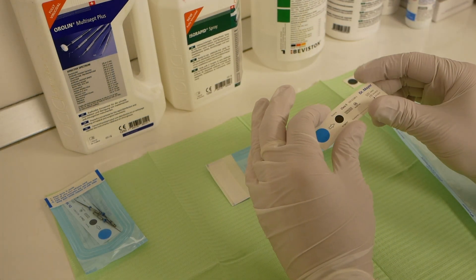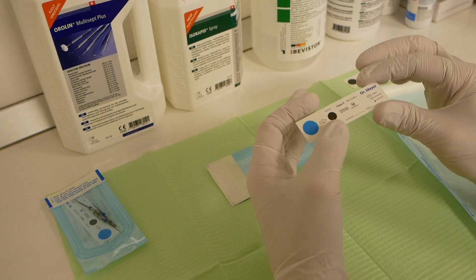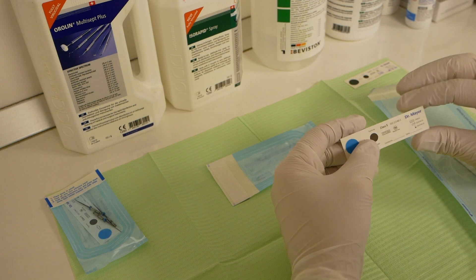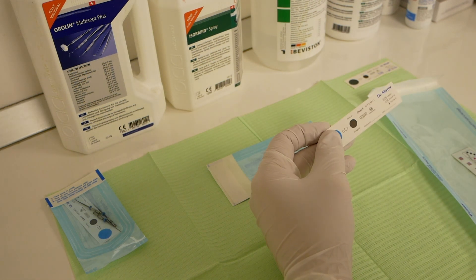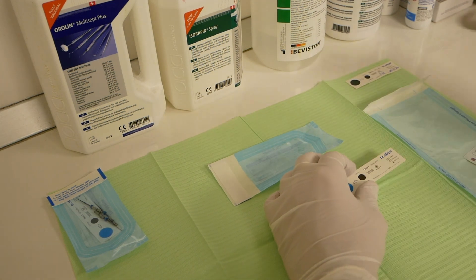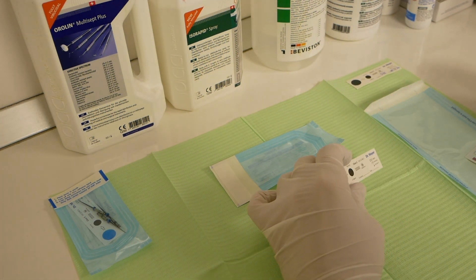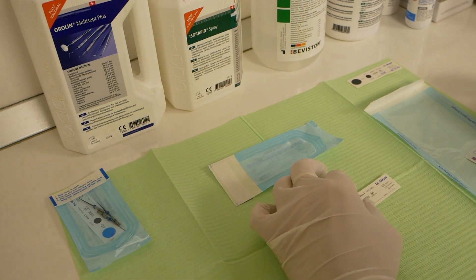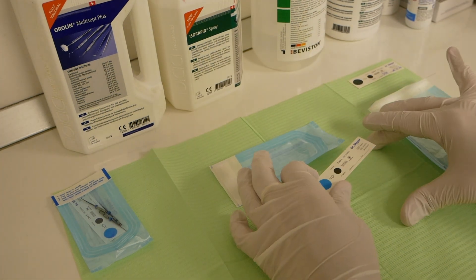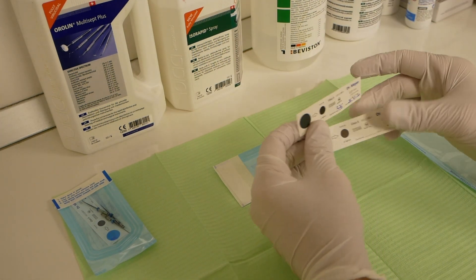Some guidelines in some countries require you to perform a Bowie and Dick or helix test before each sterilization cycle. After that, you place a Class 5 integrated sterilization strip in each bag. Whether this is overkill or not is debatable, but some legislations require it. When the strip is exposed to the proper conditions, it will turn from blue towards brown, in the case of this strip.